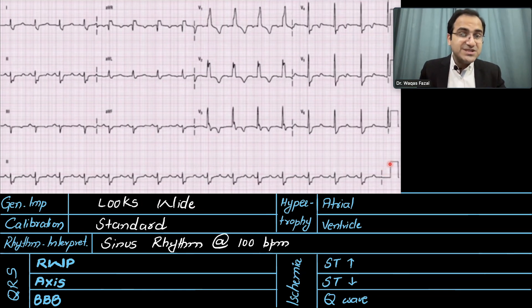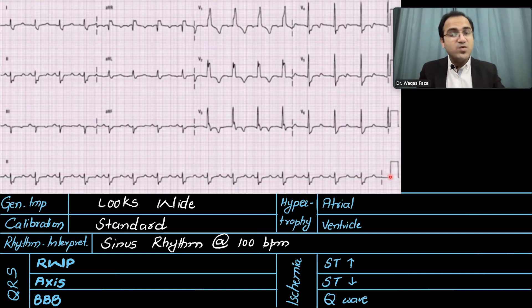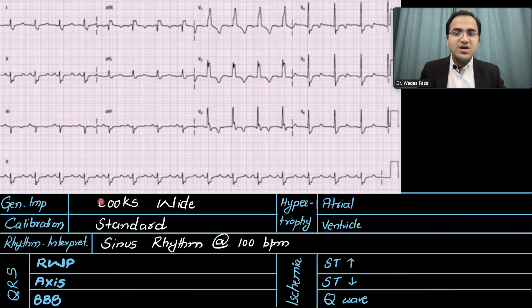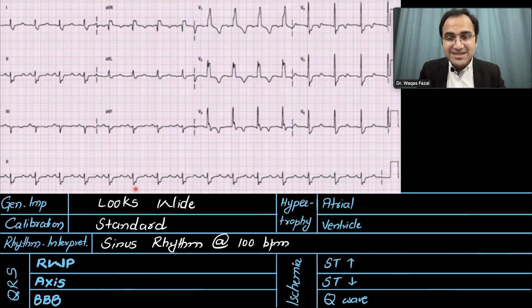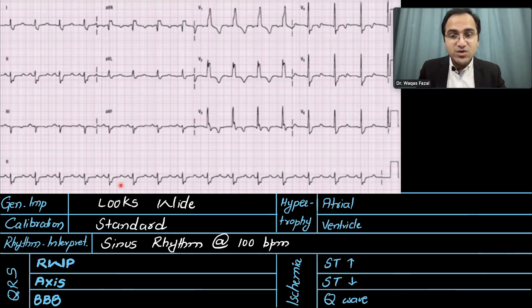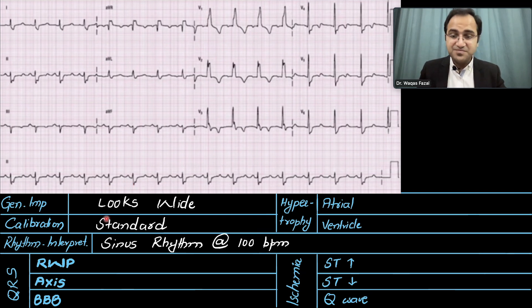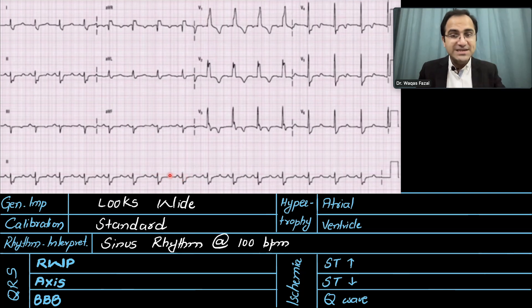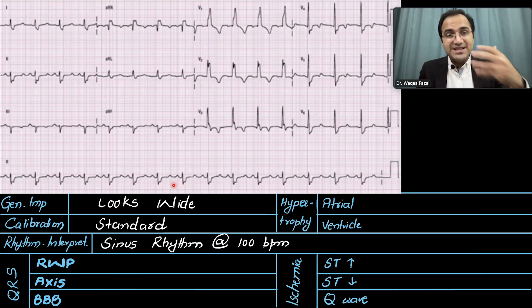The calibration is two large boxes tall and one large box wide — that is standard calibration. Let's look at the rate: we have approximately three large boxes between the RR intervals. Three large boxes: 300, 150, 100 — so the rate is 100 beats per minute. It is a sinus rhythm — the P waves are present and followed by the QRS complexes. Although they are ugly and wide, it is sinus rhythm because it is run by the SA node and P waves are present.